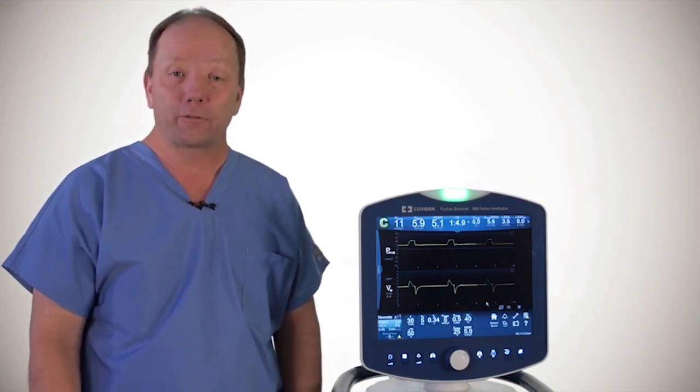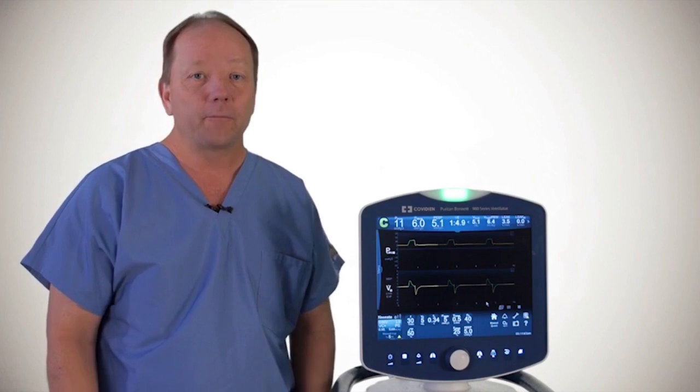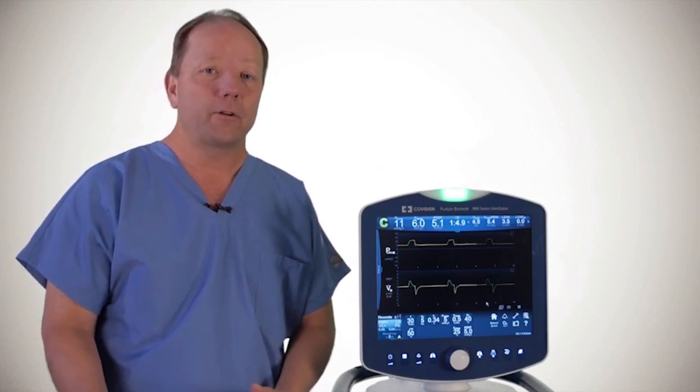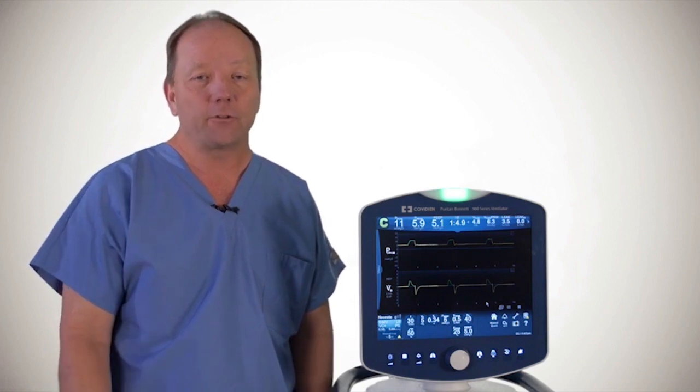Now I want to talk to you about our ProxFlow sensor capability in the neonatal 2.0 mode. Some clinicians like to have additional monitoring at the Y, and so we offer a ProxFlow sensor that can be connected to the patient Y.